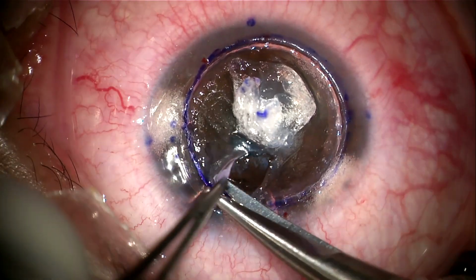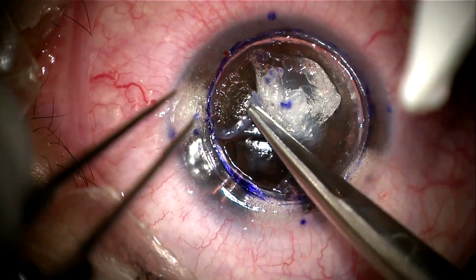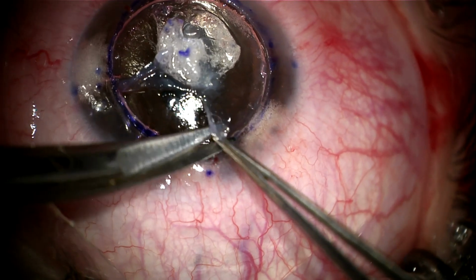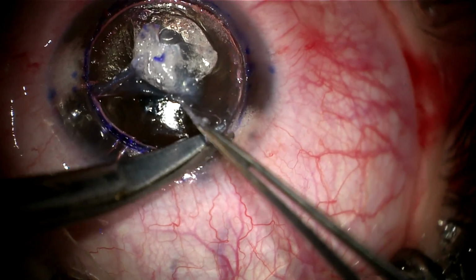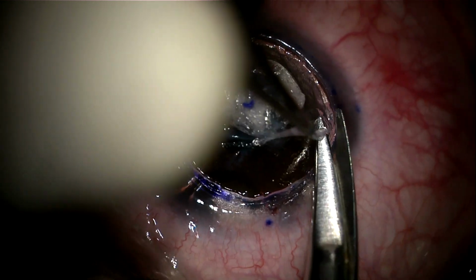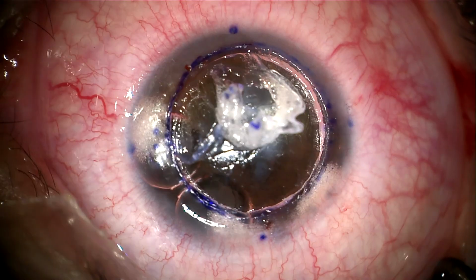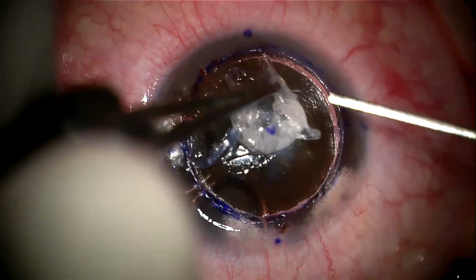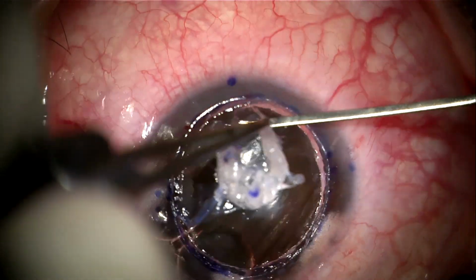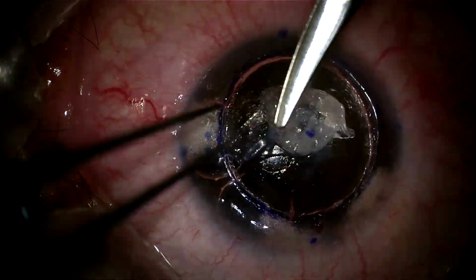It is to be noted that we are performing dissection in the peripheral cornea to avoid the scarred, thinned central part. During cutting the stroma, dissection of some areas may be needed using a spatula before using the scissors. After completing peripheral dissection, now I'm going to try to peel the central area.